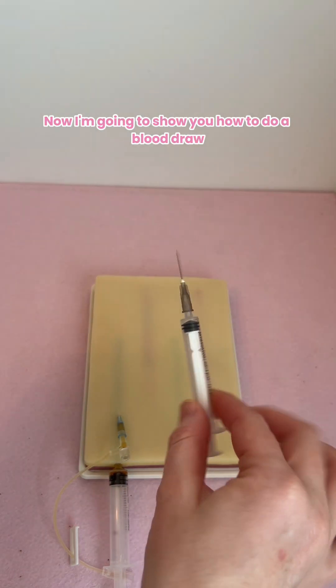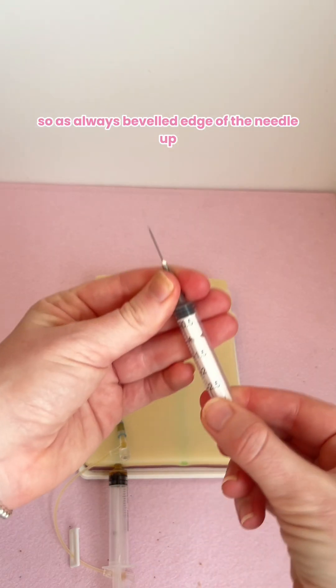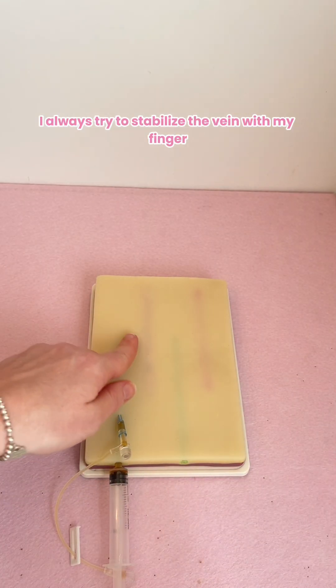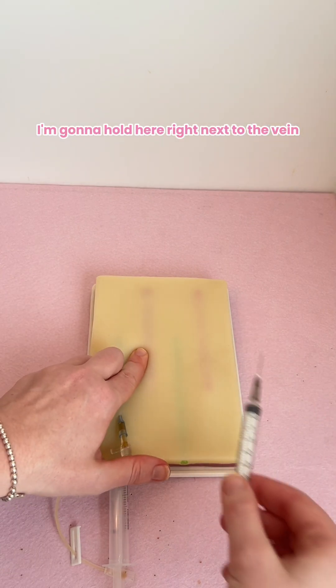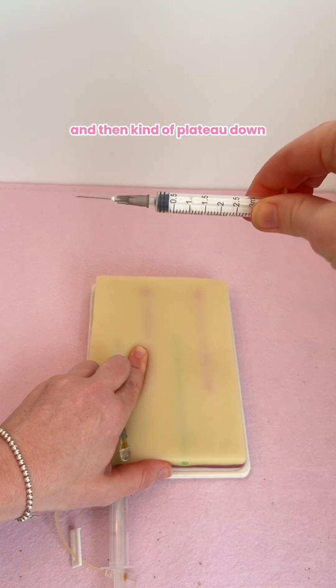Now I'm going to show you how to do a blood draw, and we're going to do that from our red closed vein. As always, beveled edge of the needle up. I always try to stabilize the vein with my finger — feel where it is first. I'm going to hold here right next to the vein, then I'm going to go in at a 45-degree angle and then kind of plateau down.